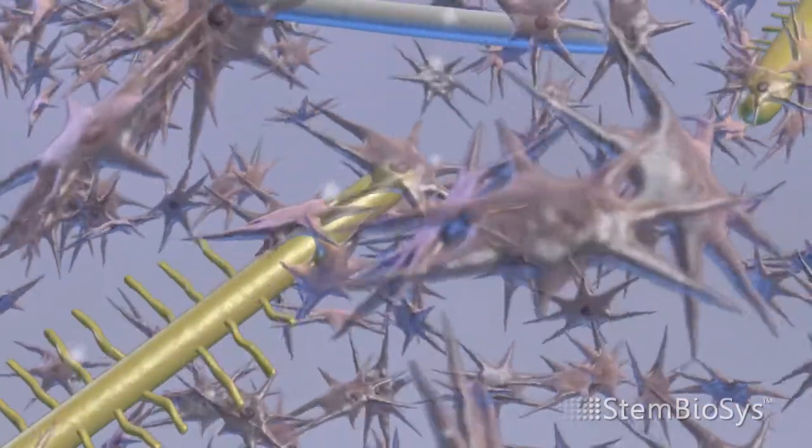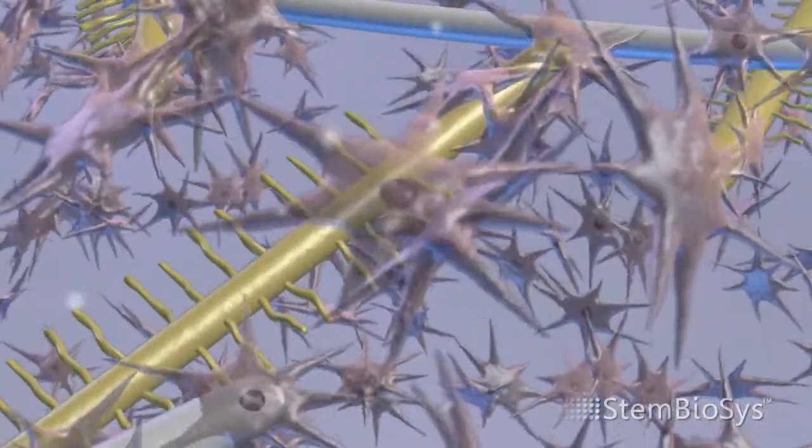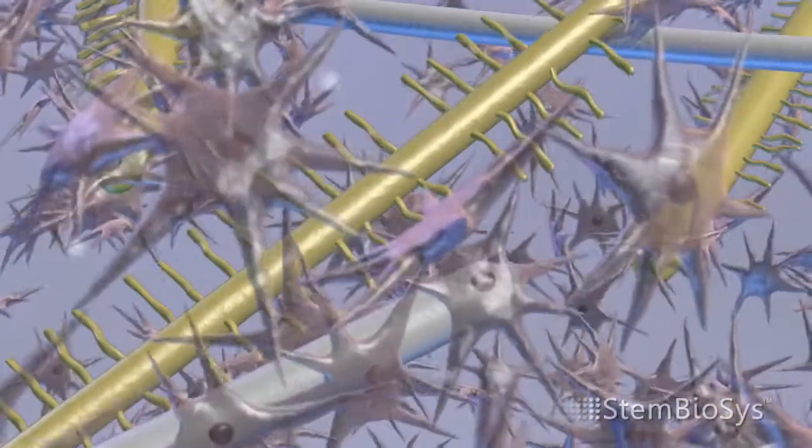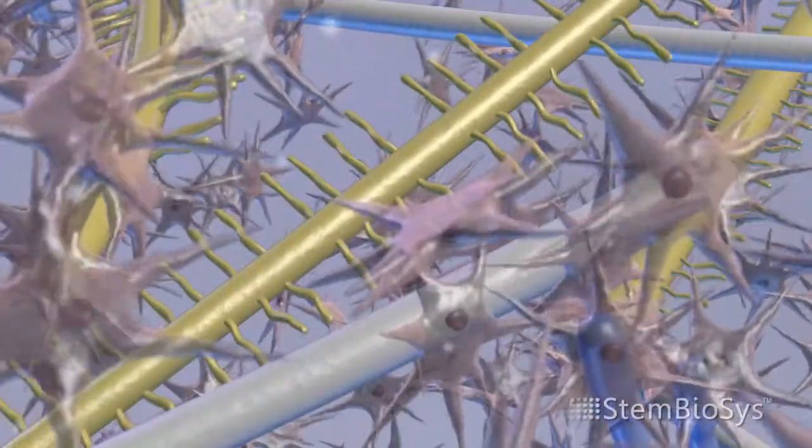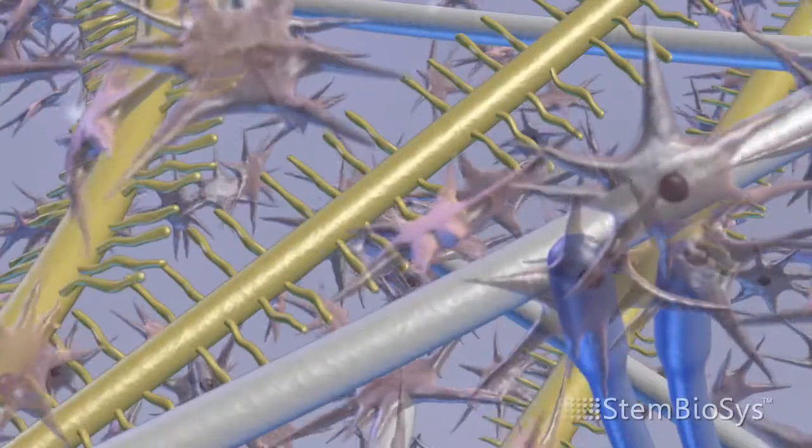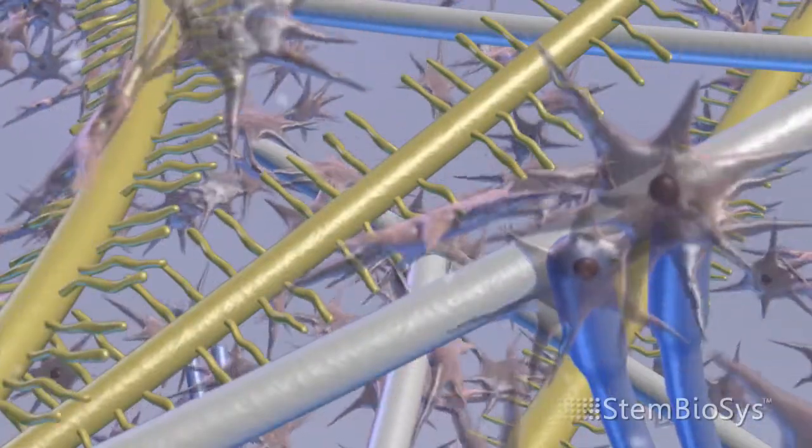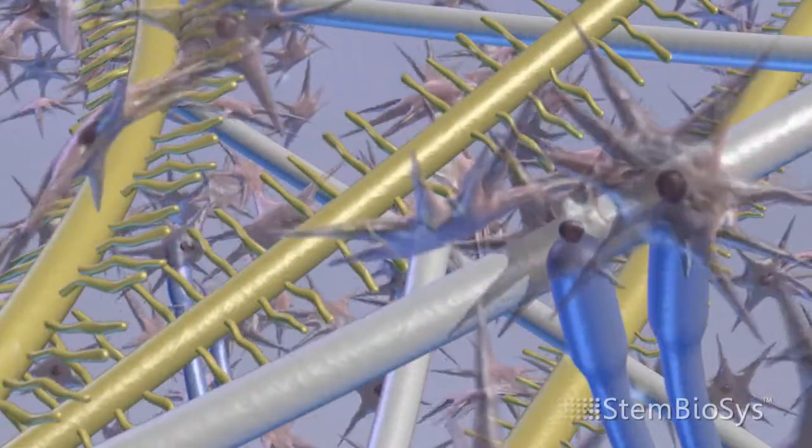The cells are then stimulated to produce an extracellular matrix. These matrix proteins are deposited in a defined and ordered three-dimensional structure, a home built by the bone marrow cells in a fashion similar to what they do in their native bone marrow.